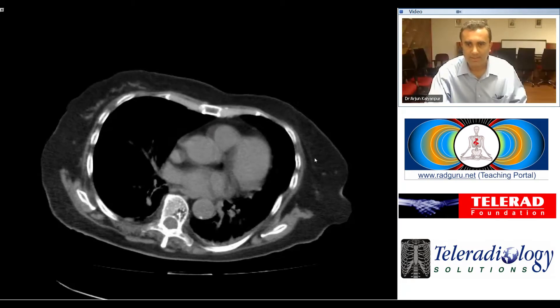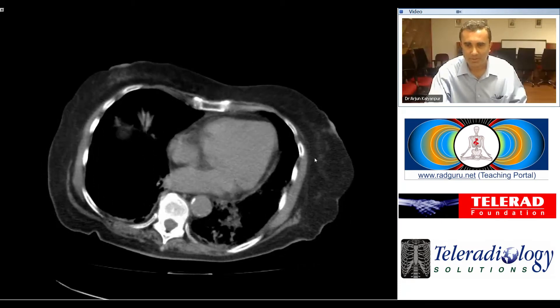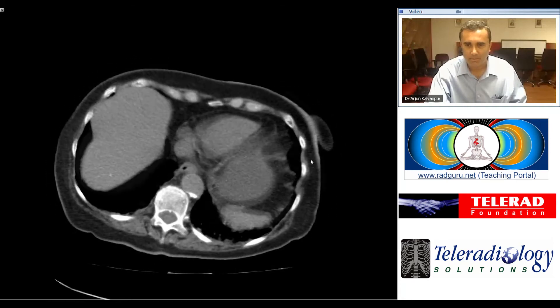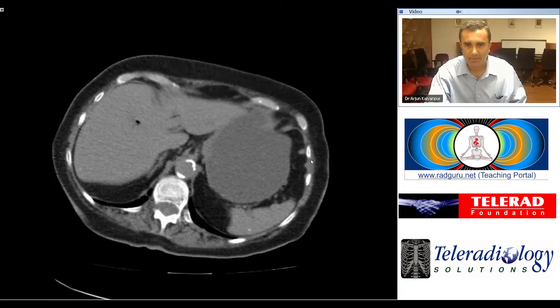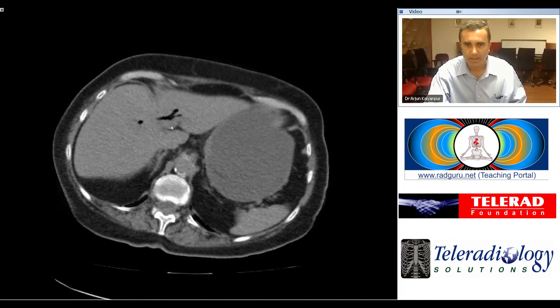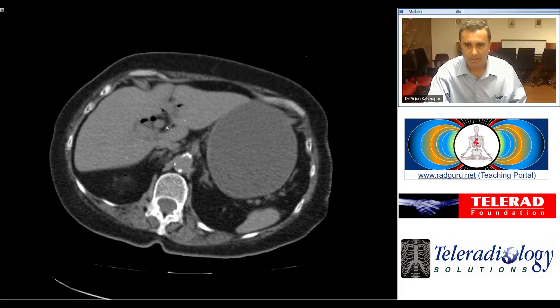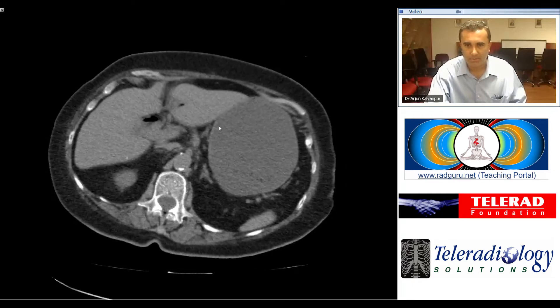This is an interesting case from the emergency room: a patient with abdominal pain. CT scan of the abdomen and pelvis. As we scan through the liver, we see some air in the biliary tree. We know it's biliary because it's very central, as opposed to portal venous air which tends to be peripheral and non-dependent.